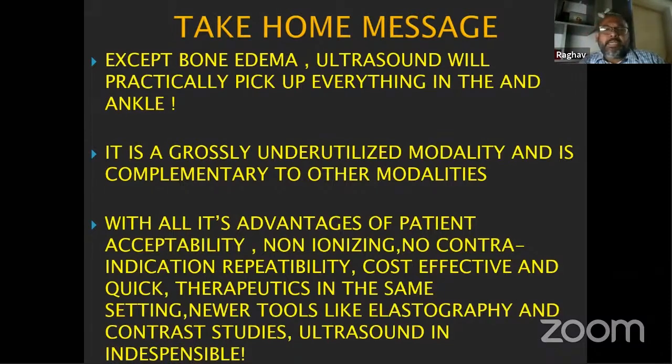And with all its advantages of patient acceptability, being a non-ionizing modality, no contraindications, cost effectiveness, being quick, being of therapeutic use, and we have the other newer modalities, I think ultrasound is indispensable for musculoskeletal pathologies in general, and specifically in foot and ankle, where we could do dynamic examinations and also do therapeutics along with that. I think with that, I will end my presentation.